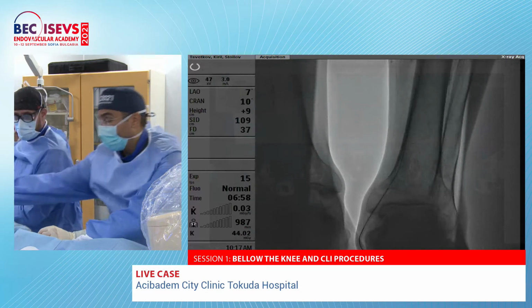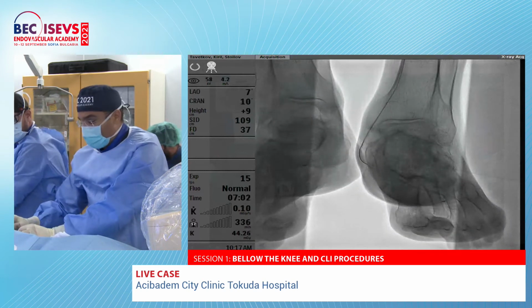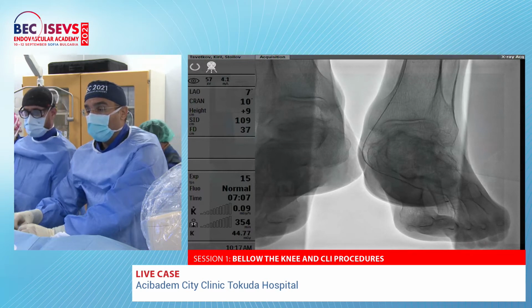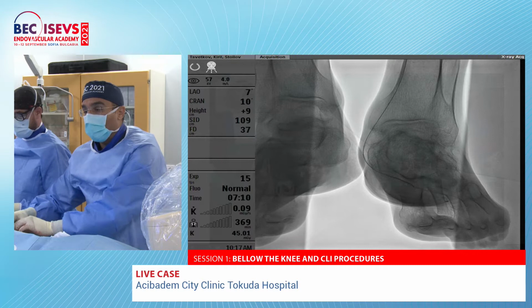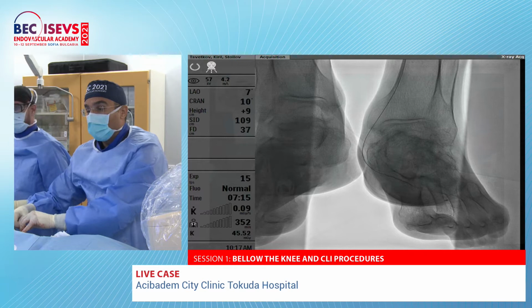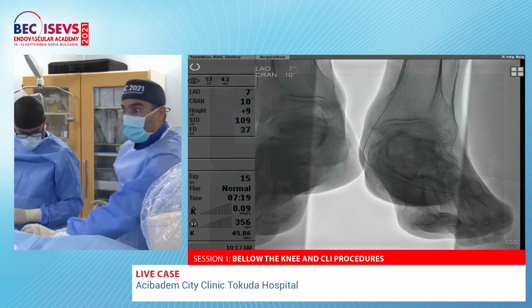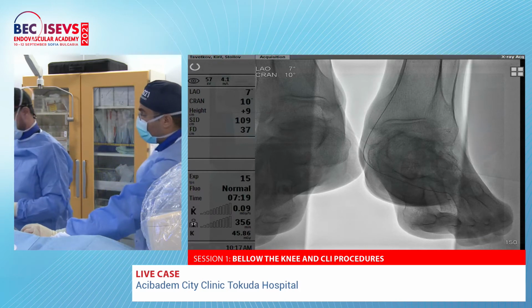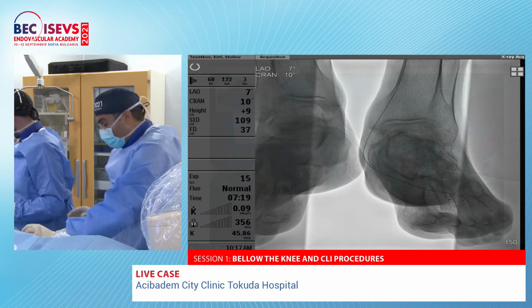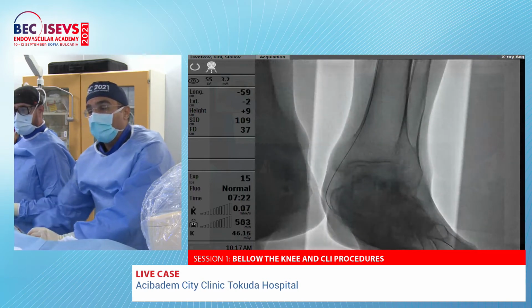It is good that we are down to this part. We will see if we are inside the artery, but it seems that we are in a right position because you see here the artery, it goes directly to the posterior. We will stop here. We will check just to be sure that we are inside, even if the Command 18 is an aggressive one, but I'm pretty sure that we are in the right position. The posterior tibial artery was also the most important runoff.